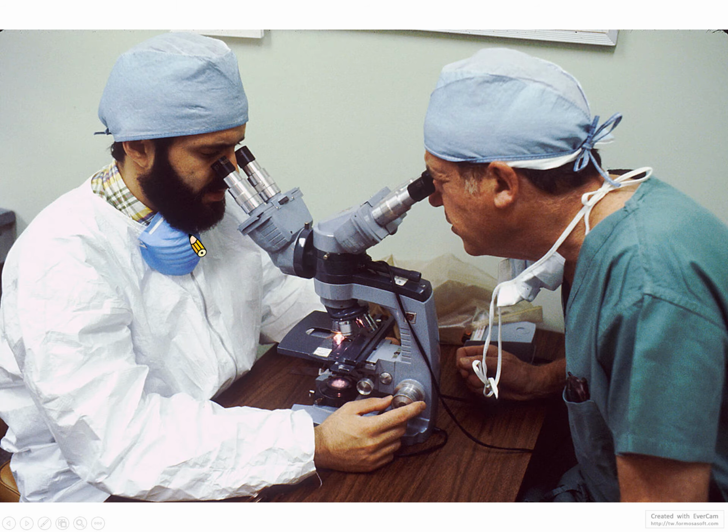Okay. So now, because we already prepared the pathology slides, the next thing is that the surgeon and pathologist will work together to look at these slides to determine whether this is a benign or cancerous tumor.